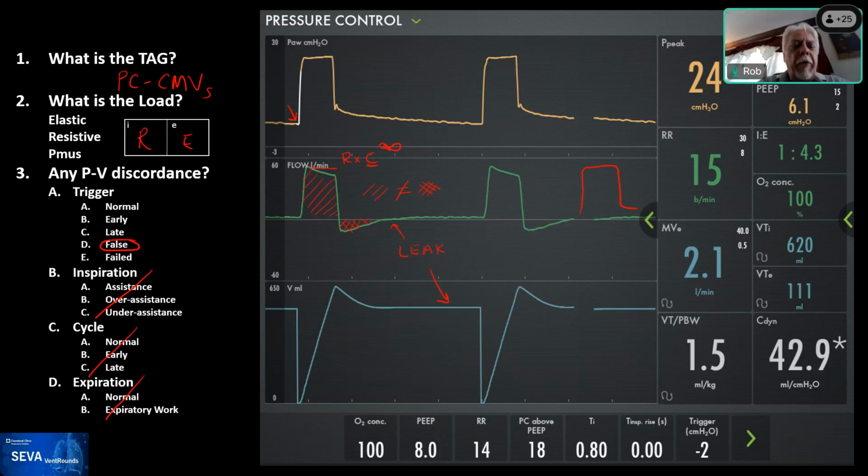Well, if we have a leak that's a fixed orifice, like a tube with no cuff or a very small cuff, then you have to assume that the size of the leak is the same on inspiration versus expiration, right? Yep. And if that's true, then it will be affected by the leak, although the inspiratory volume will probably be affected more because of where the pressure source is coming from. So I think the answer is you don't know.